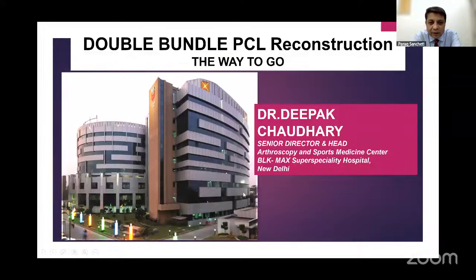And the tibial insertion has also been very well defined on the bundle ridge, which is present 5 to 6 millimeters from the champagne glass drop off, and the arthroscopic point is between the shiny fibers of the medial meniscus and the champagne glass at the bundle ridge. I'll show you in my video presentation.